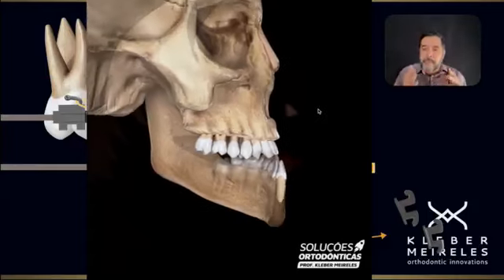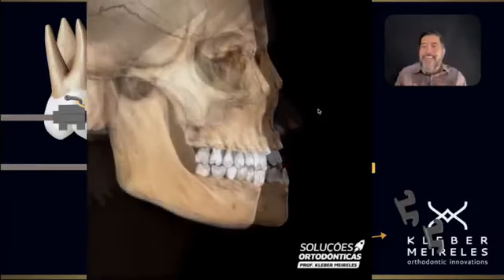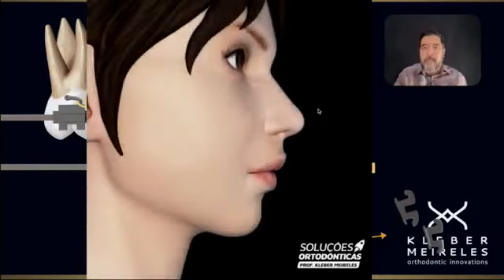Are we putting the teeth outside of their housing, outside of the symphysis and the anterior segment of the maxilla? Is that what we want? If you pay enough attention to some posts on the internet, Instagram, Facebook, you'll see that many people are applying this concept, using TADs in the lower arch and doing the retraction of lower teeth using the hook, the high hook, the long hook.